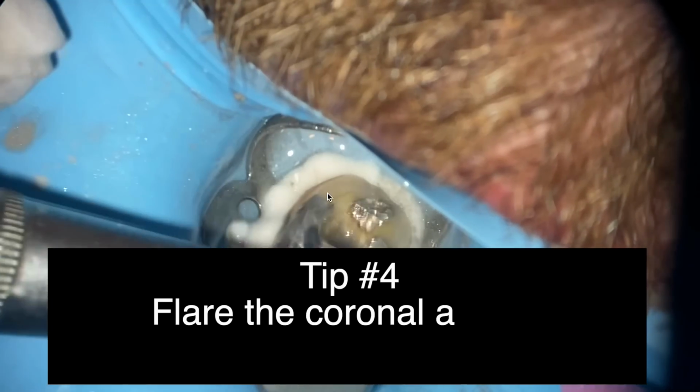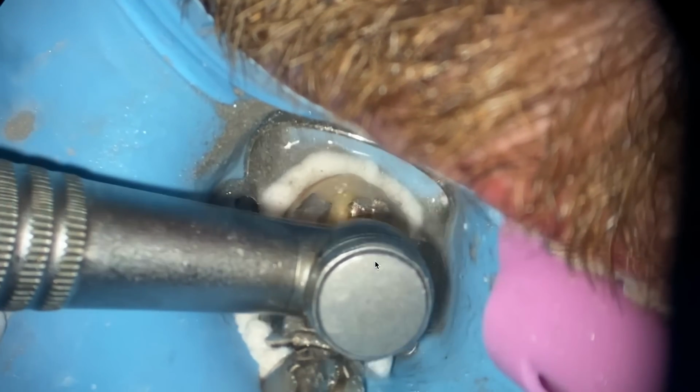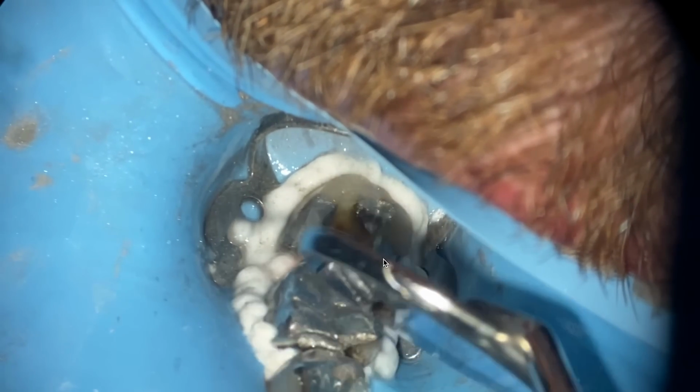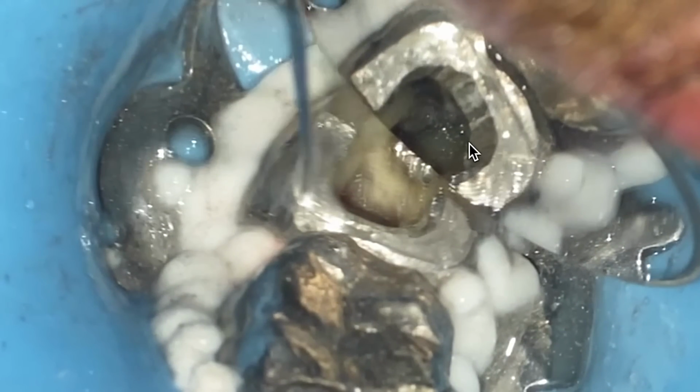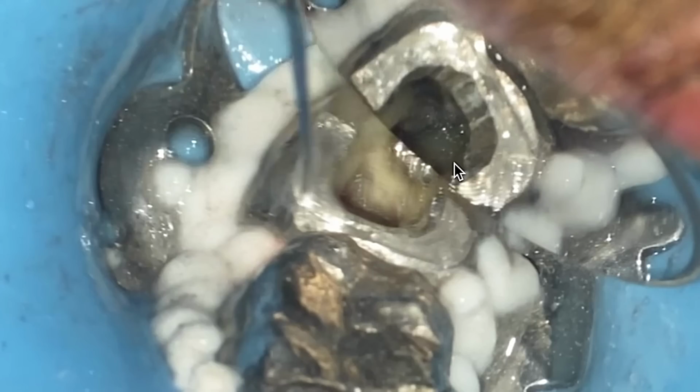So another tip is just flaring this coronal part of the restoration. We're getting rid of that anyways, or we're going to replace it. What that helps us do is bring more light into our preparation, but it also allows files and whatnot. Right there, see that bevel? It allows hand files and other instruments to access the tooth a lot easier.